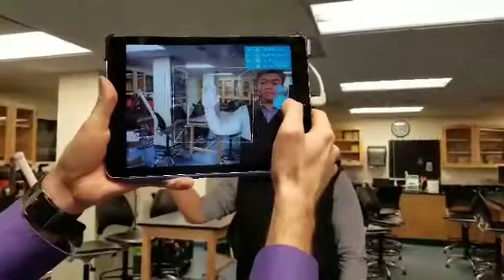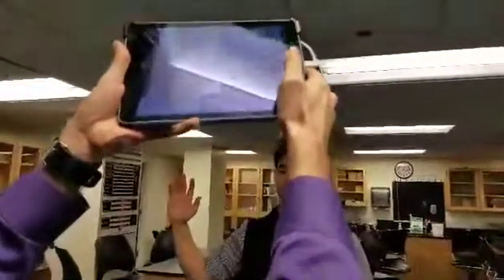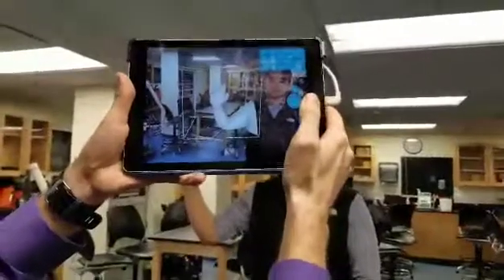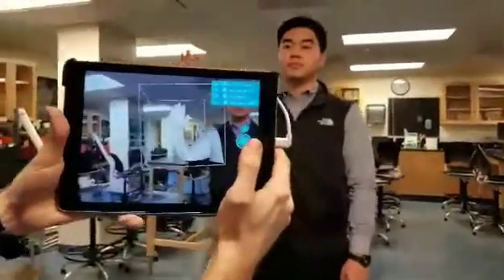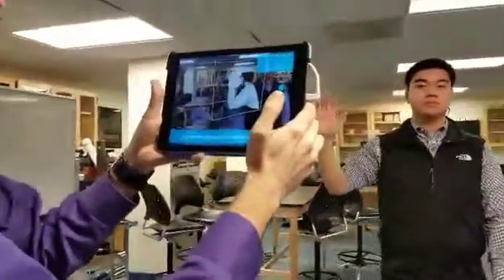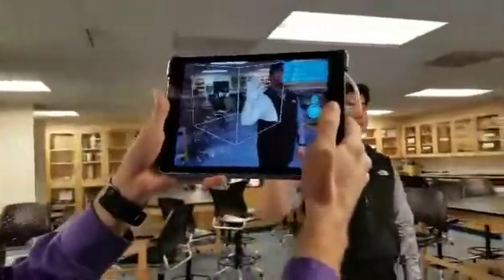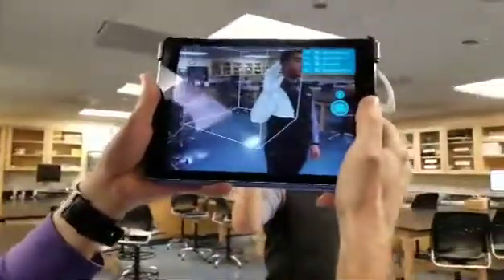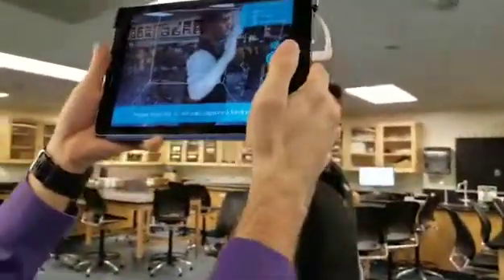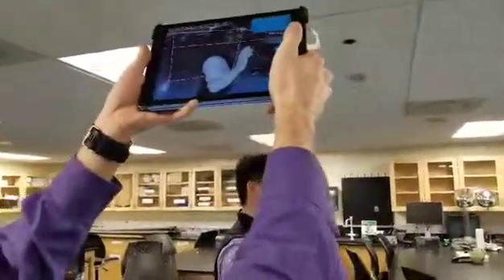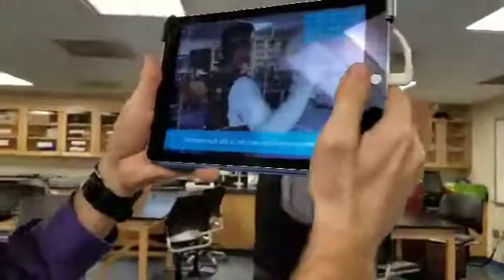We click scan and we can see we're getting all of his shoulder, his whole arm, all of his fingers, and we've filled it in. Now to fill in the rest of the scan, we need to start moving up to get the top of his hand and move down to get the bottom of his hand and arm — you'll be walking around to fill this in. As I'm walking around, it'll hold up a message: 'please hold still so we can capture a keyframe.' You don't always have to obey that — it's not always necessary. As I walk around, we can see the scan is filling itself in. Slant up to get an upward view and go down to get a downward view. The scan is getting better and better.